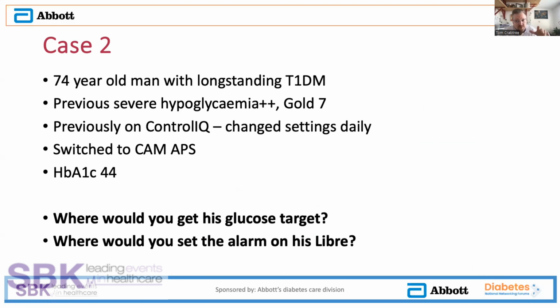Now, he'd previously been on Control-IQ, but he liked to fiddle with it, for lack of a better word. He just loved to fiddle with the settings, and he changed them every day, which then meant that it was really difficult to pick out what settings needed changing in clinic or if there were any patterns, because no day was working off the same settings.